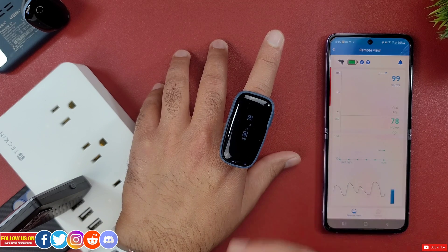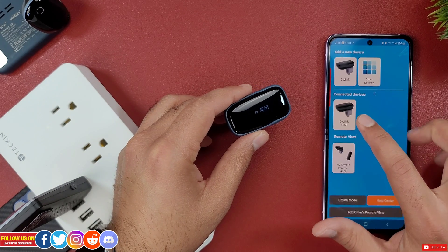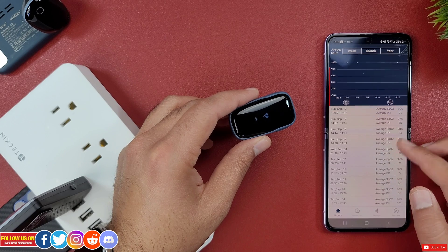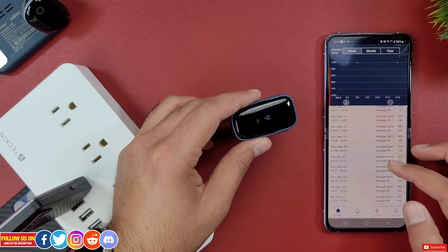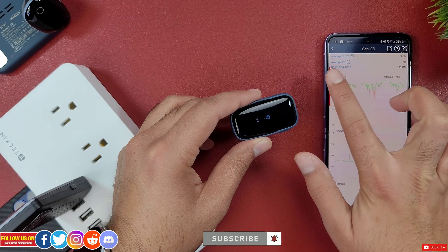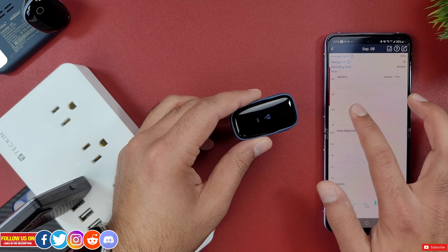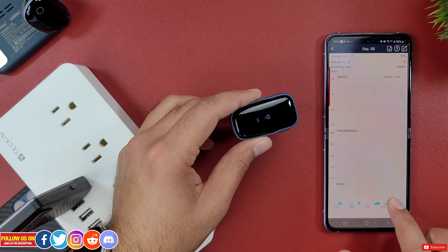You can also access the OxaLink monitor from the V Health app by tapping on the OxaLink — not the 'My OxaLink Remote.' This will open the OxaLink monitor and auto-download the last four measurements. From the dashboard you can access past recordings. I've been using this OxaLink for many nights — here's a sample reading showing average SpO2, average pulse rate, recording time, and graphs for both SpO2 and heart rate, with pinch-to-zoom on the graph.